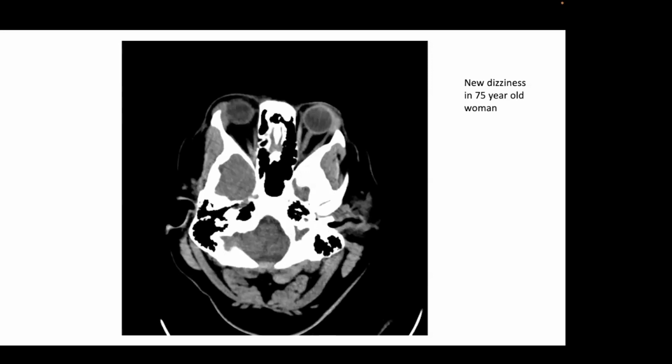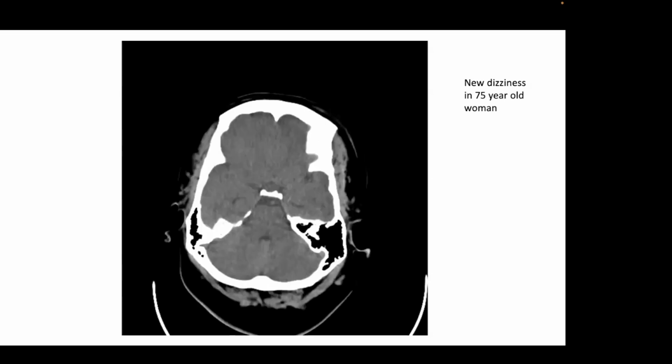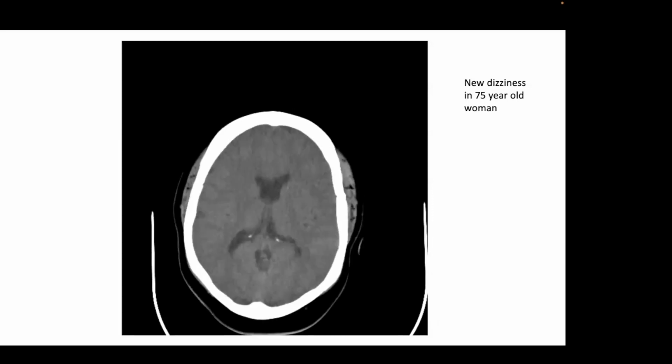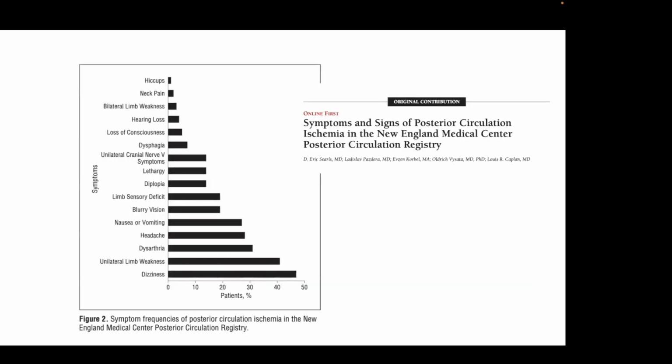So I think that if you call this in every patient, you're going to have a number of false positives, and I can only tell you from my experience, it's just very difficult to make the diagnosis on CT. And if you suspect posterior fossa ischemia, you could really just skip the CT scan, I think, and go to MR.